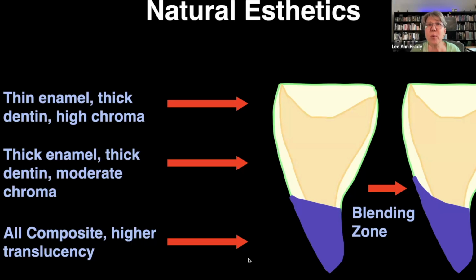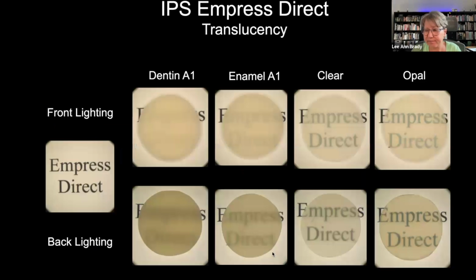So probably number one trick for beautiful anterior aesthetics with composite materials is long bevel, etch well beyond where you end your bevel, taper the composite out there, and then thin it down to a really beautiful, what we call an infinity margin. Okay. And trick number two, which is really what we're going to spend the rest of our time together talking about, is that the value is the most important thing to match. Value is way more important than chroma.